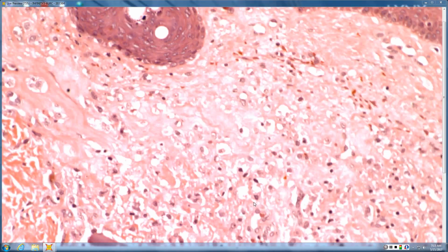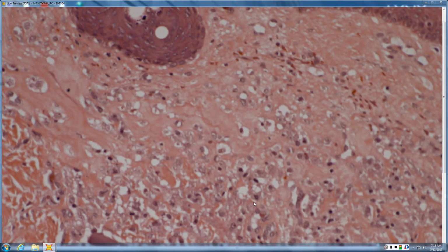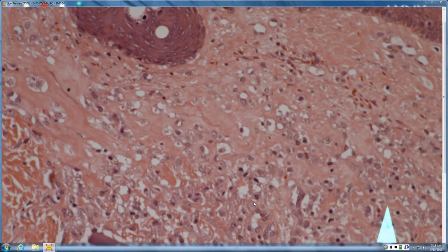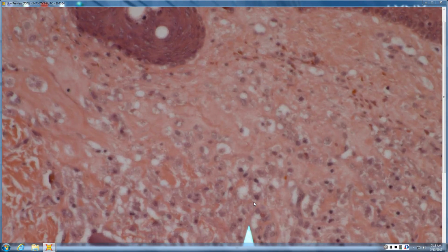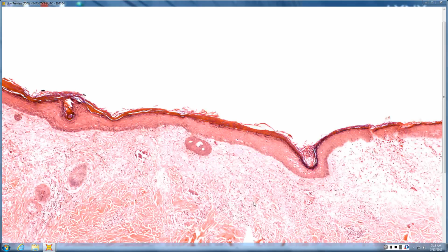Sometimes those aluminum chloride granules can be so focal and finite and visible that they look like little tiny intrahistiocytic organisms, and so it looks almost like leish. You can kind of make that out here, but they're more just this amorphous appearance. But you don't want to confuse that with leishmaniasis. It's just aluminum chloride pseudo-leish. That's pretty much it for that.